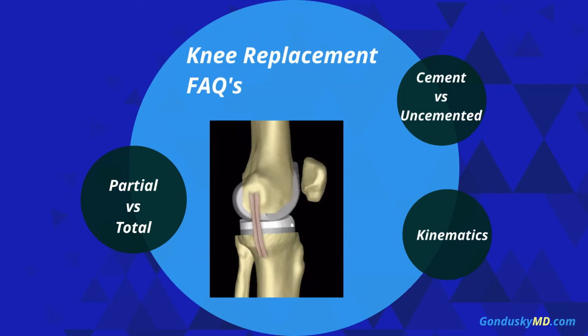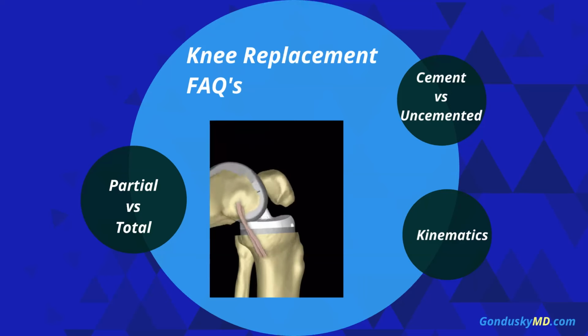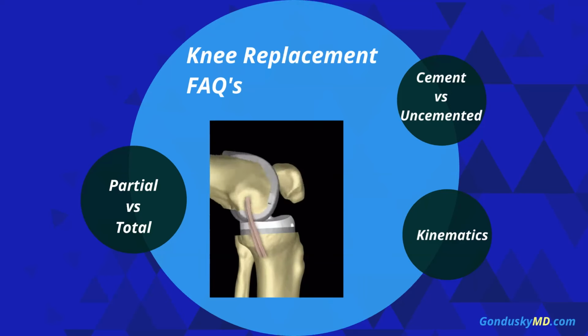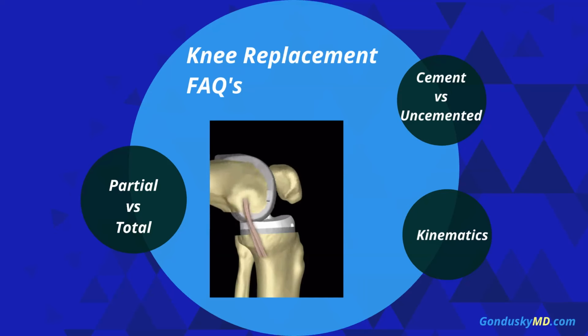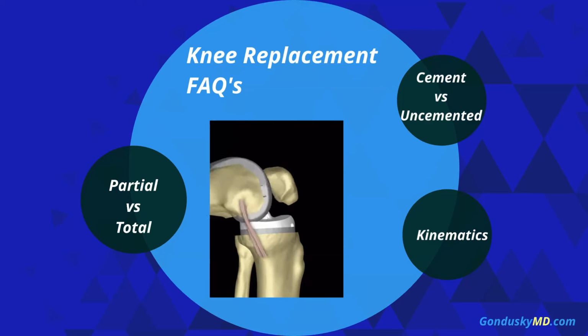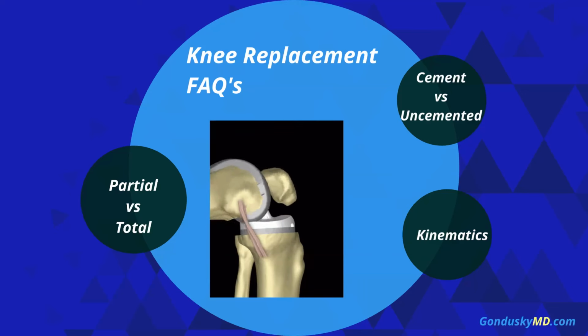Custom knee replacements are something that people talk about. You can get things like preoperative MRIs or CT scans to look at bony anatomy to create custom knee replacements for people. The results of these have been fairly mediocre in studies, and so most people do not use these. They really have shown no benefit, and in fact, some unique issues with them. And so, for the most part, these tend to be uncommon and pretty low volume procedures done with these type of components.